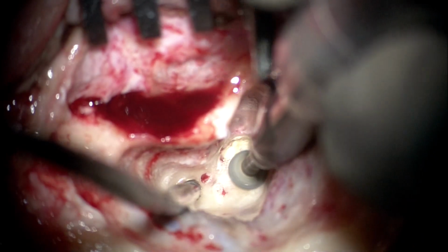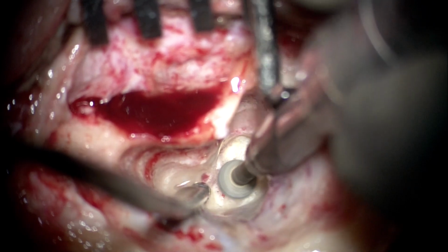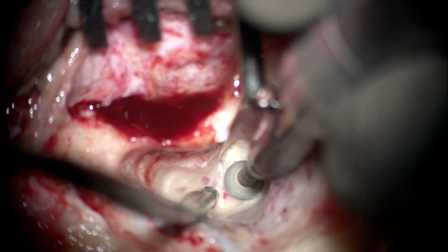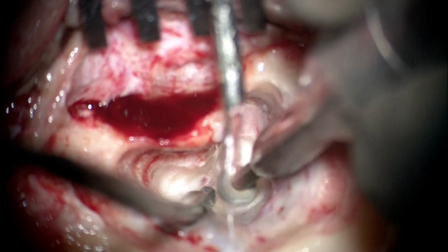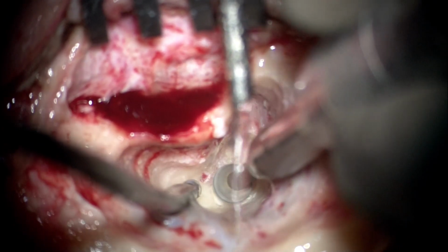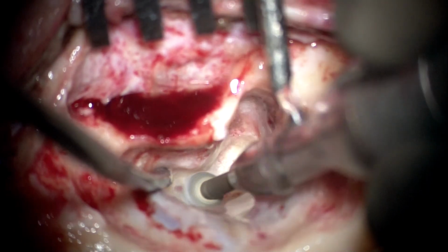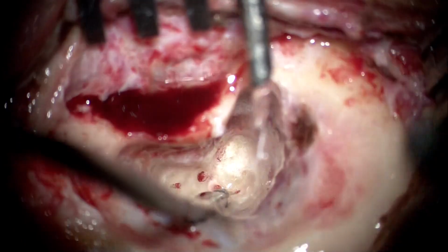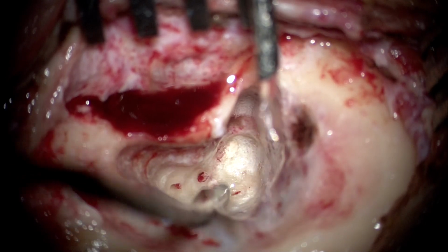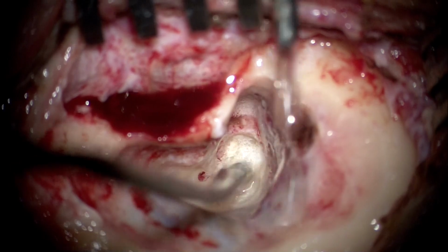As mentioned, we are not to transgress the superior ampulla anteriorly and superiorly, to safeguard our labyrinthine segment of the facial nerve. Posteriorly, we can remove as much bone as possible towards the dura and towards the sigmoid sinus. We can see that the crus commune has just been opened with this drilling.